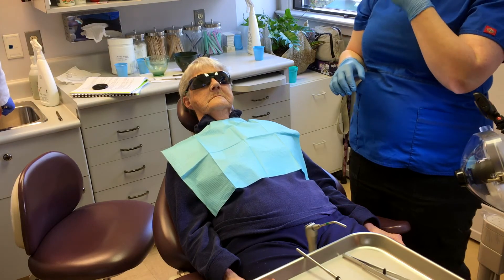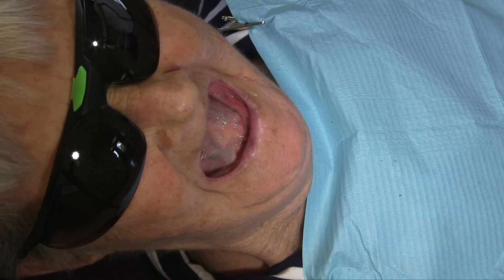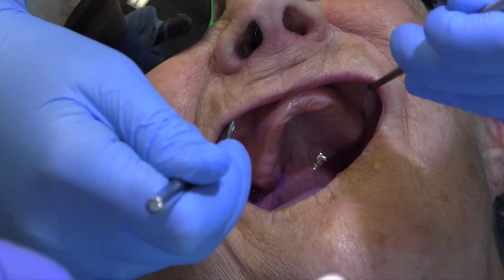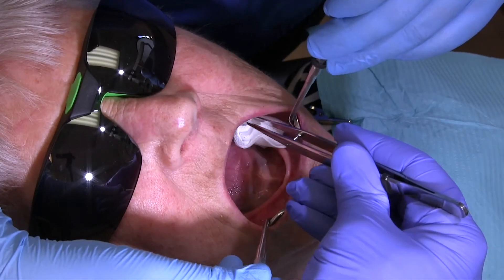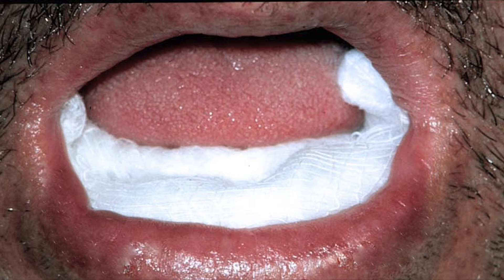Place the patient in a supine or reclined position and instruct the patient to relax their lips and cheeks. Prepare the patient for the impression. Lightly and quickly dry the tissues using cotton pliers and folded gauze. In the mandible, use the same technique or pack some gauze in the floor of the mouth.